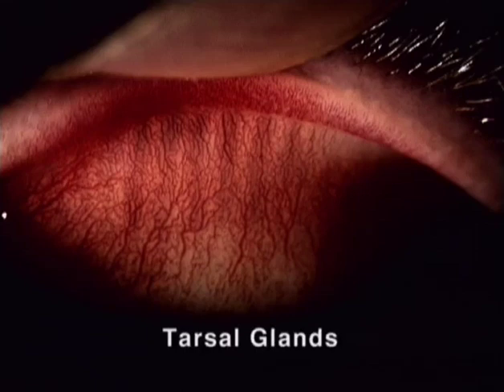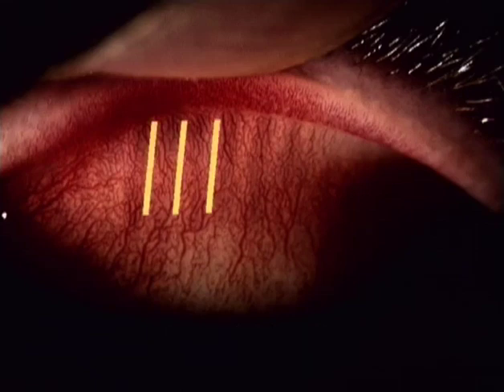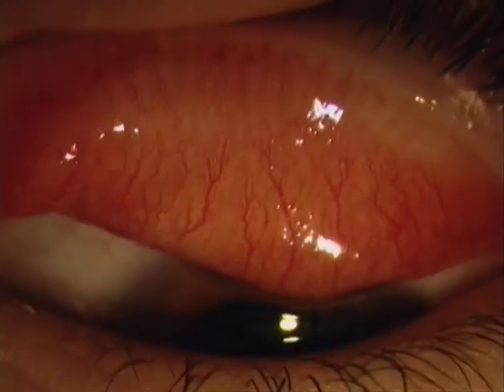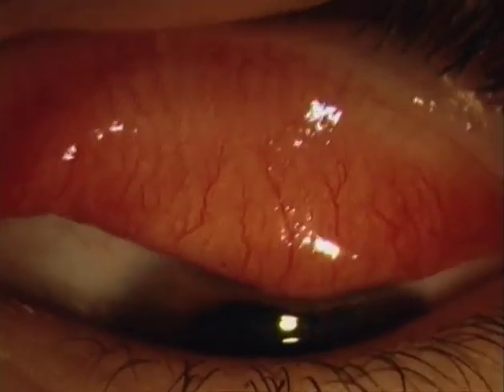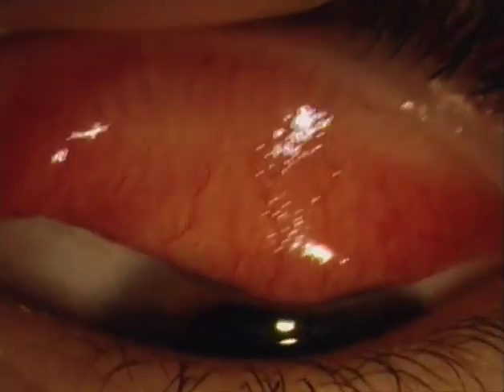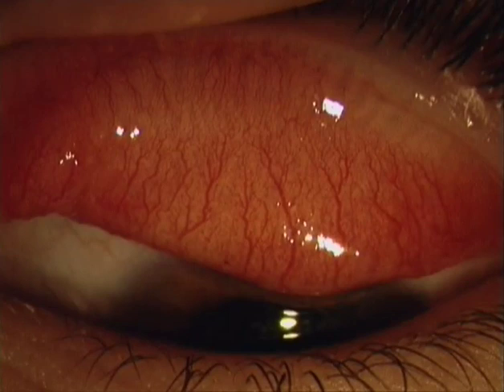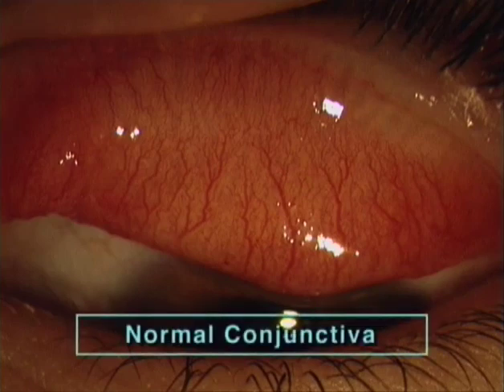Behind the typical vascular pattern, we see bright parallel stripes, the columns of the tarsal glands. They may appear hazy, as in this image, or they may appear more distinctly in areas where the blood vessels are empty, as shown here. The visibility of the vascular parallel pattern and the tarsal glands' parallel stripes is the sign of a normal conjunctiva, that is, a sign of its transparency.